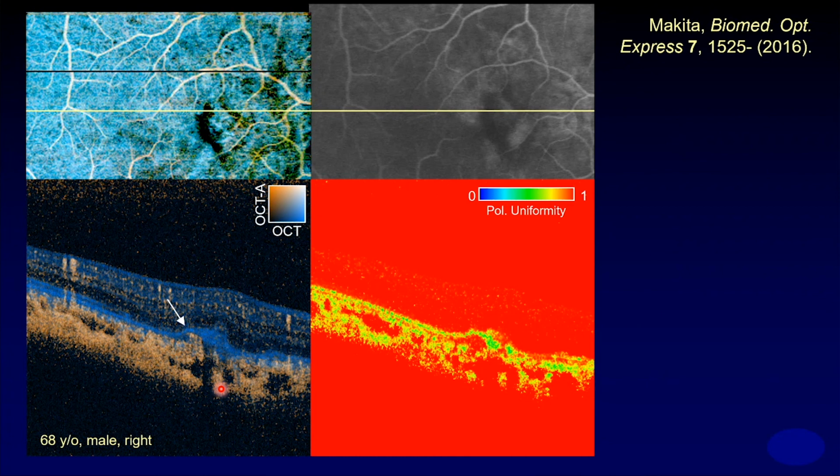But the point is here, all of the blood vessels beneath the retinal pigment epithelium and even the melanin signature have recovered here, right? So actually, we can double check it without any labels or invasiveness. Okay.